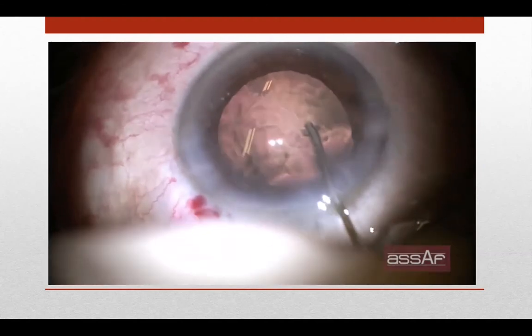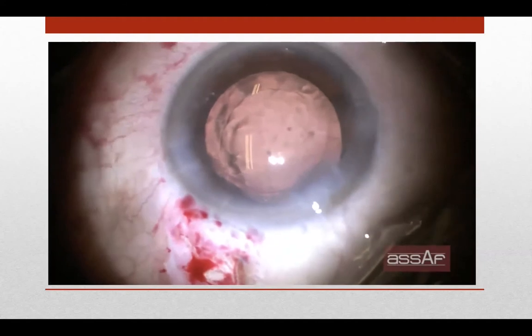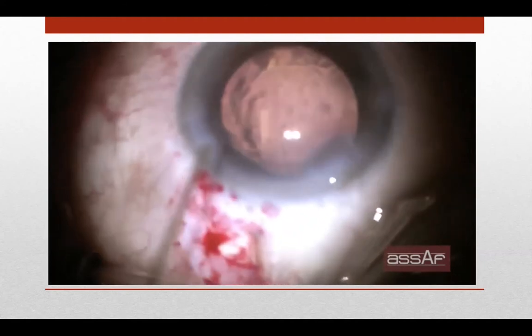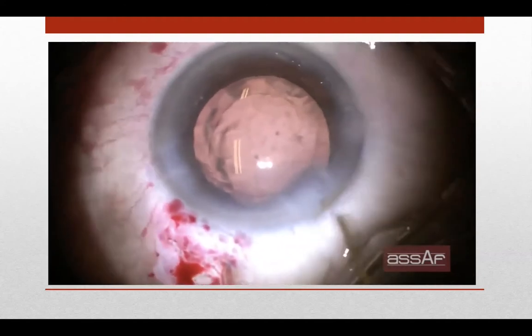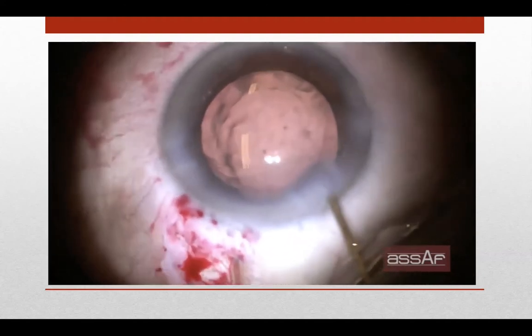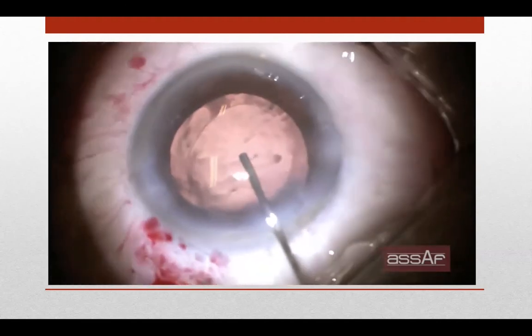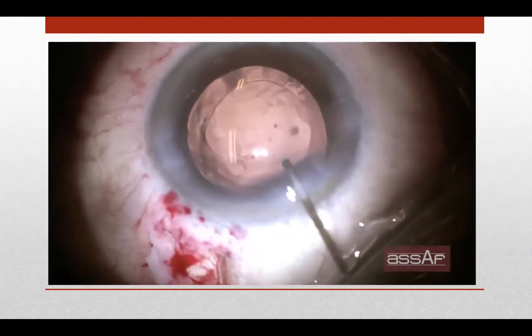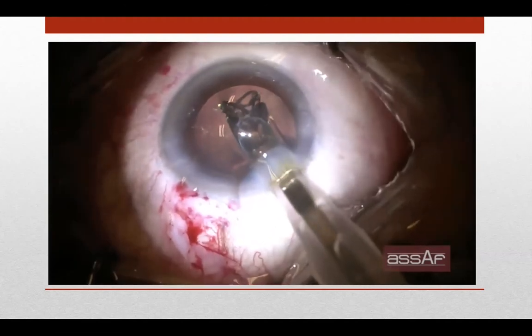So I had very good capsular support from the posterior capsule, although I had a break. After injection of dispersive OVD inside the capsular bag, you can see that the break is limited to the far periphery, and I had good capsular support to continue implantation of the trifocal single piece lens.